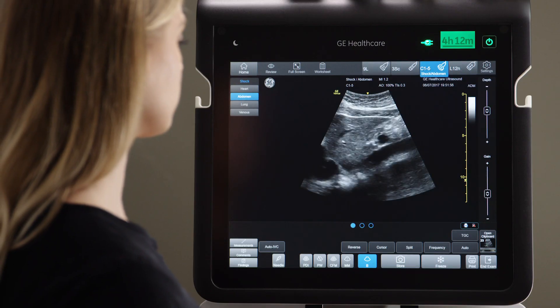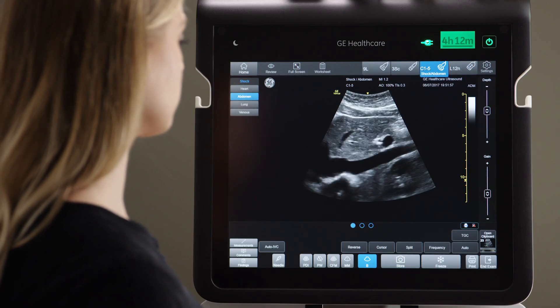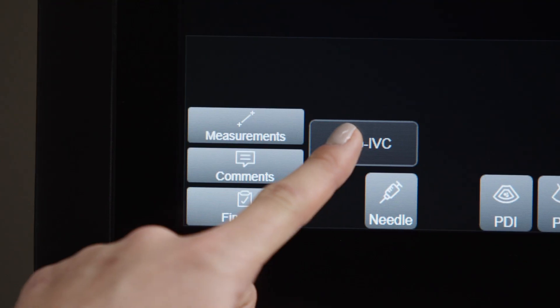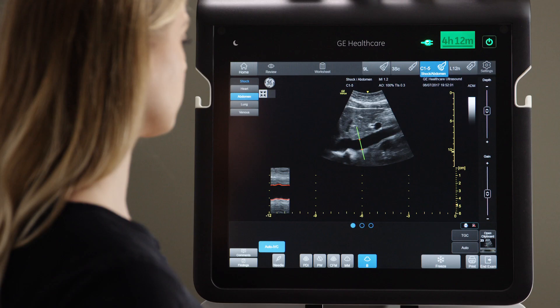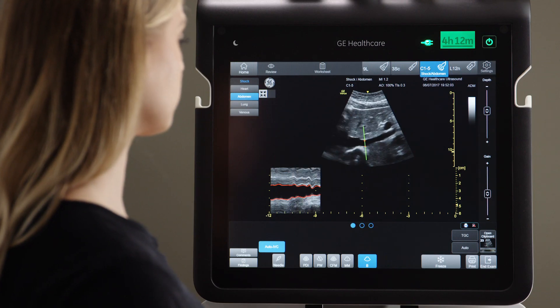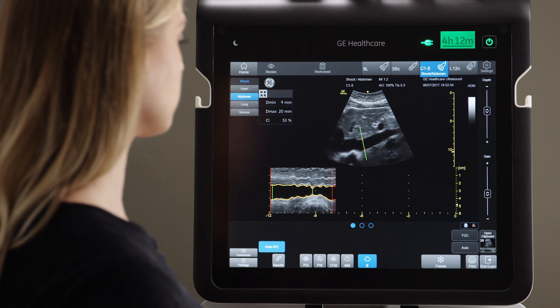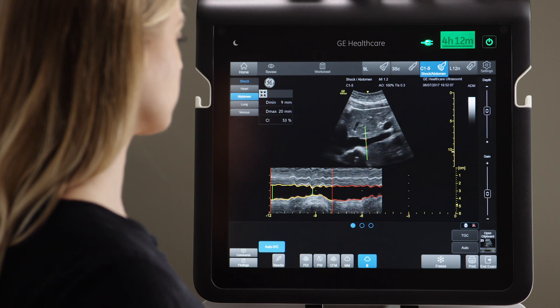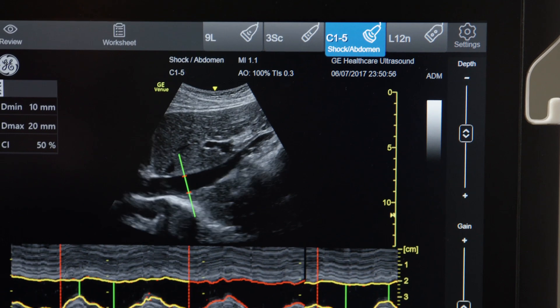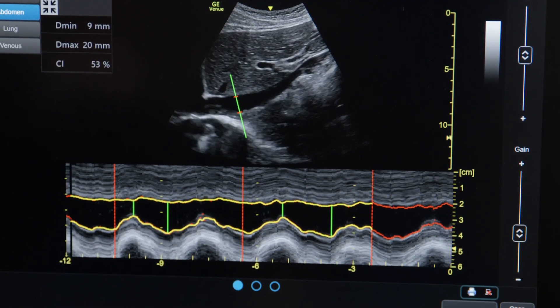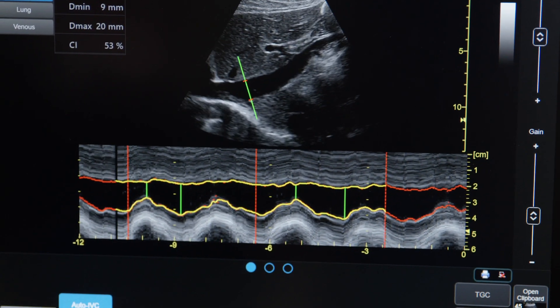Find the IVC, making sure the diaphragm is in view, then press the Auto IVC button. Venue searches for the appropriate place for you to measure the minimum and maximum IVC diameters within the breathing cycle. Not having to make manual measurements may save you multiple steps and time.